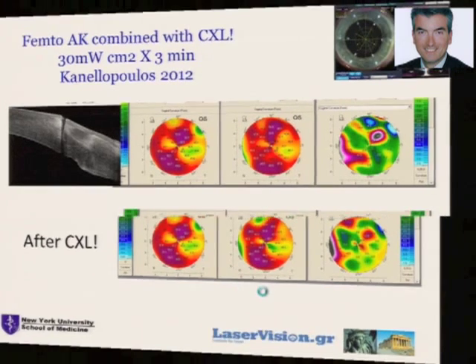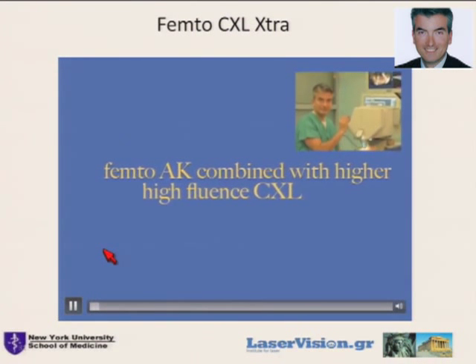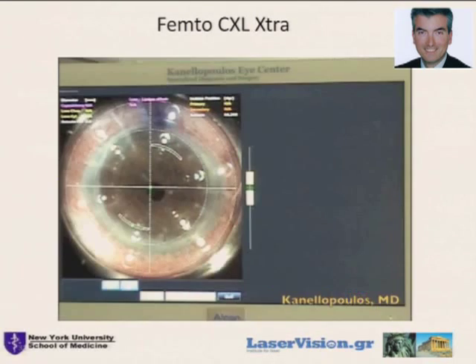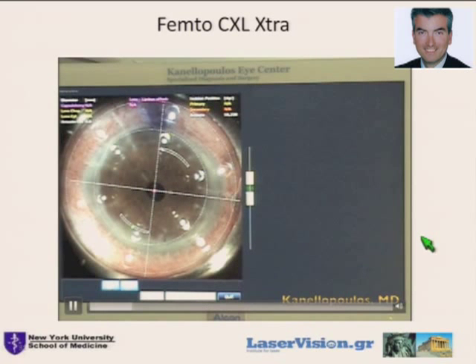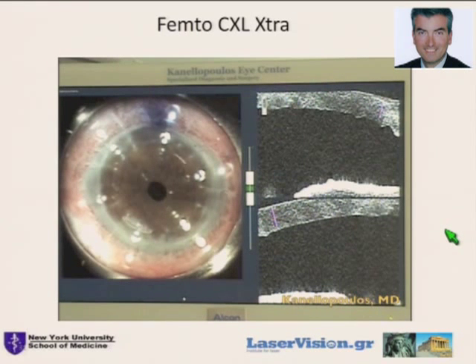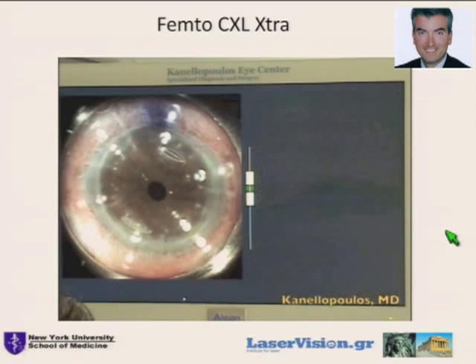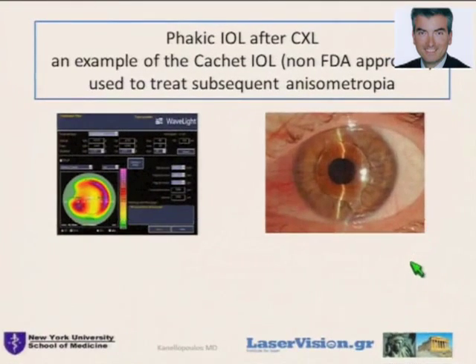Hello, this is John Kanellopoulos from Athens, Greece. A fascinating new procedure. This is a very high astigmatic result in a penetrating keratoplasty. We're going to use the tremendous LenSx option you see here, cyclorotating to the 6 o'clock mark, and then centering on the pupillary center to perform these very small arc, 30-degree astigmatic keratotomies at 85% depth, superior and inferior done, and now we're going to see these on slit lamp. 50%. So I think this will be a great improvement.